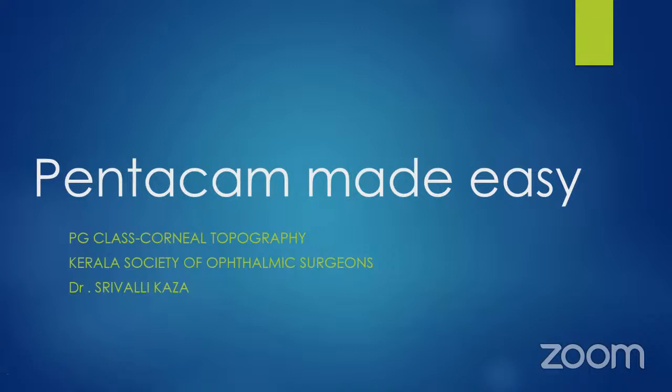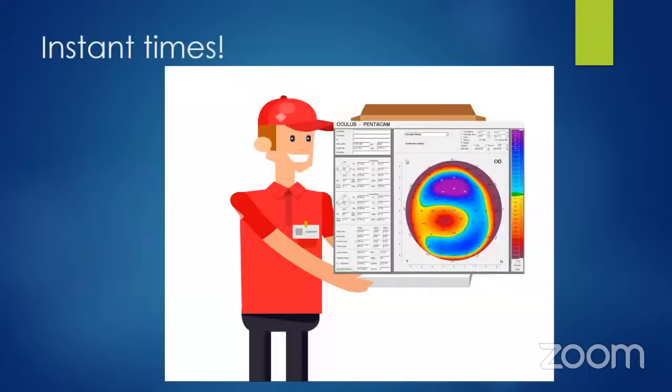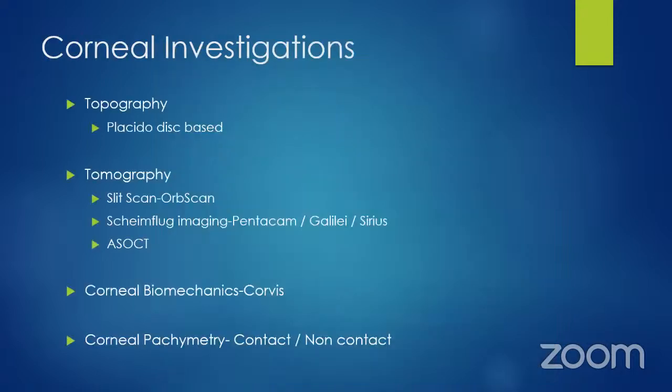So as I said, this is just a very quick recap. We stay in a lot of instant times, and we don't really have too much time to go into much detail. So it's like an instant pizza delivery, and we'll try to make sure that within 30 minutes you are knowing about Pentacam. The corneal investigations, Dr. Anil had dealt with in very much detail.